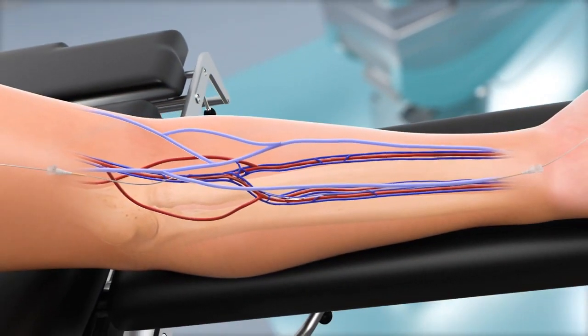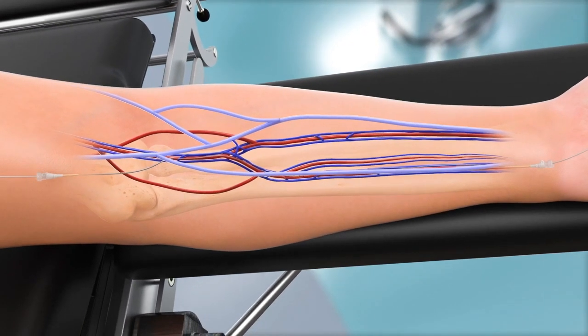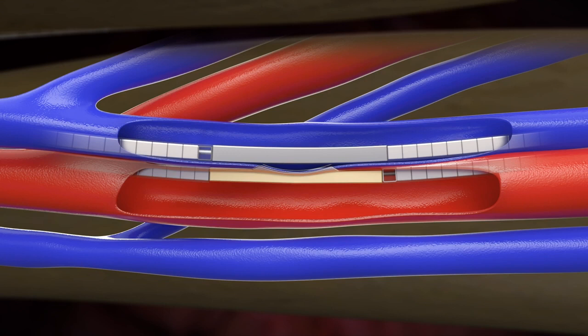These steps remain the same for the anti-parallel approach. The catheters will just advance from opposite directions and the rotational indicators will be in different locations. Regardless of approach, confirm that the catheters are properly aligned. Under fluoroscopic guidance, remove both guide wires.